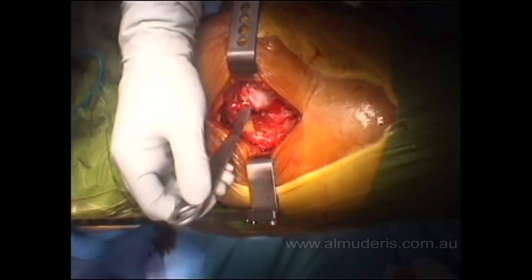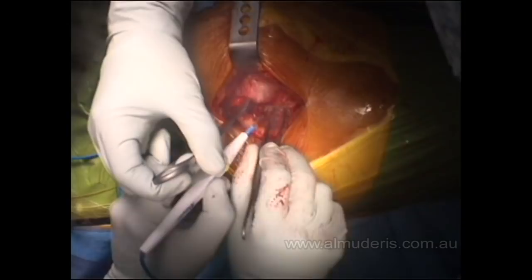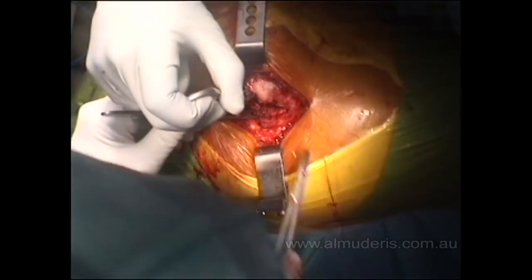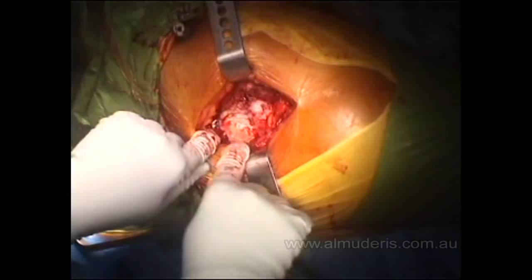This is the quadratus femoris, which is very large in this patient. There is usually a vessel at its superior portion. Once the lateral rotators are identified, go through them with the diathermy, then place a stay suture in the lateral rotators. The hip is then dislocated and the femoral head is on view.